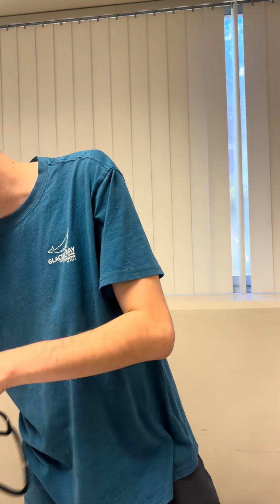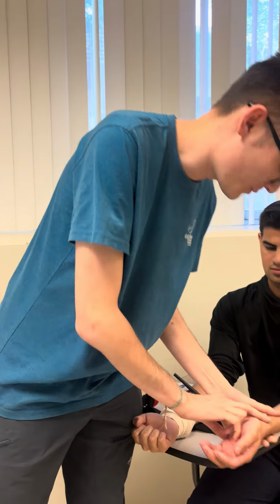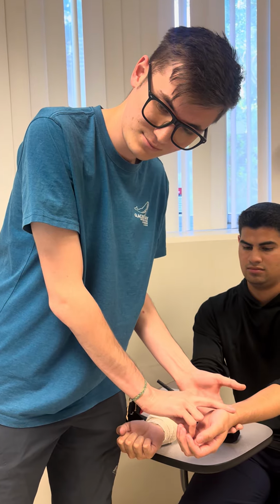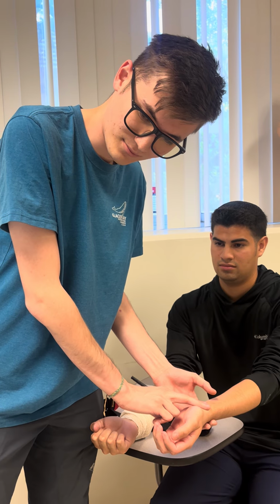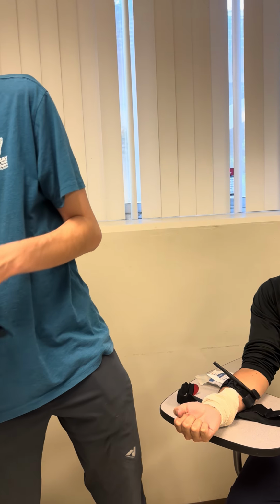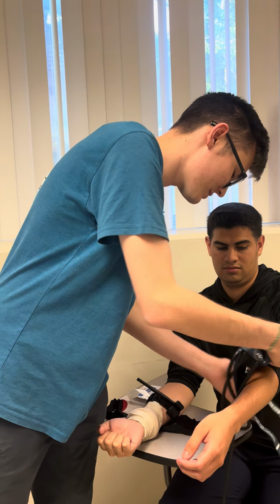So I put him in the ambulance, and while we're going, I'm going to quickly take some of his vitals. I'm going to take his pulse from the other arm for 15 seconds. His pulse is elevated. I'm going to quickly take the blood pressure there as well, just to get the baseline stats.